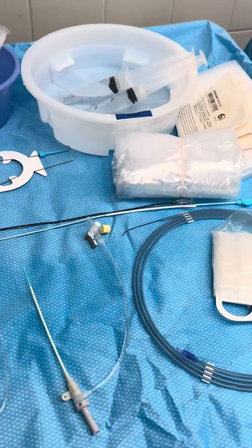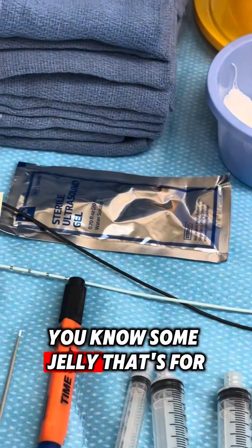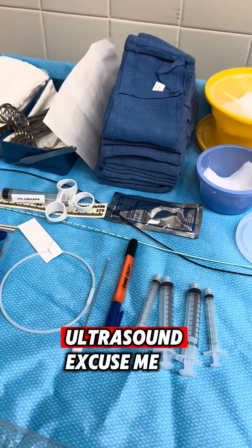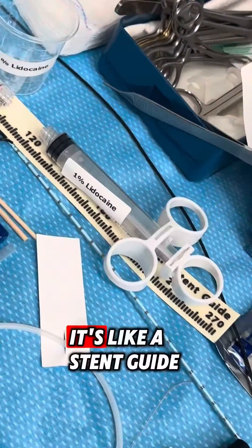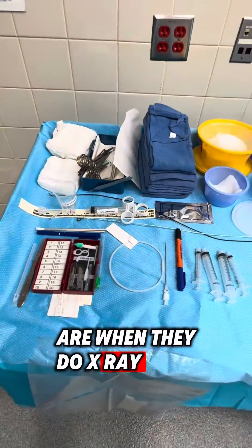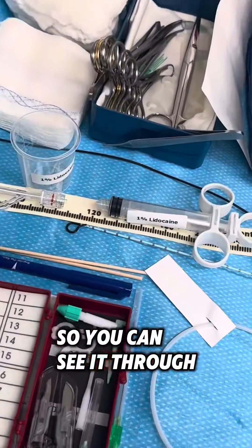Free it down on the wire — you've got those two catheters there. You've got some jelly, which is for the ultrasound. There's an 11 blade. They also use this stent guide — it's like a ruler — to see where they are on x-ray. It's radiopaque, so you can see it through the x-ray.